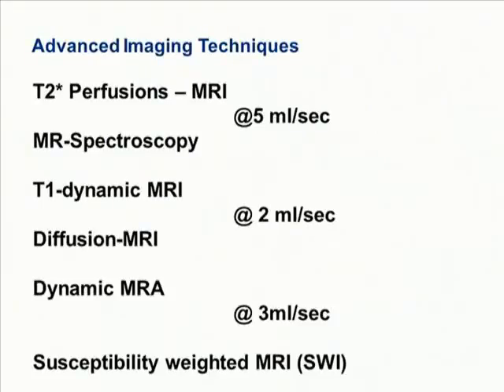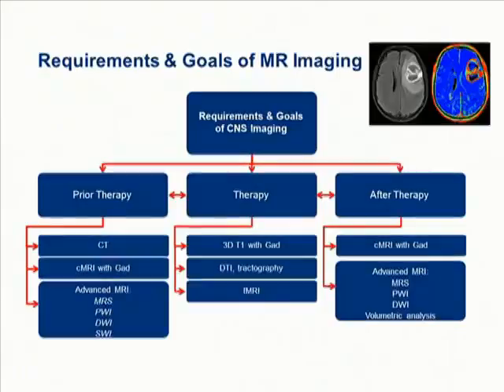And very important to know, and one of the speakers will address that in great detail, is that we are now not using only one contrast media injection. In many of our clinical protocols, we do inject contrast media several times. And on the other side, in respect of costs and safety issues, we have to stay with a certain dose, and therefore we need to introduce techniques that allow us also to scan at a lower dose.